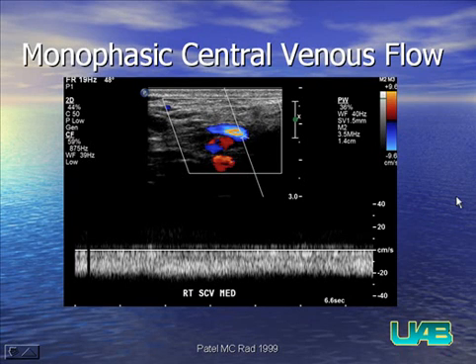When you see draining vein thrombosis, or when you see anything that causes a low volumetric flow, if you haven't identified a proximal abnormality, meaning an inflow or anastomotic or proximal draining vein stenosis or thrombosis, then you should start moving farther along the flow toward the central venous system. Typically we will follow the draining vein up the arm and go to the subclavian vein and then try to infer central flow of the brachiocephalic veins with our spectral Doppler.